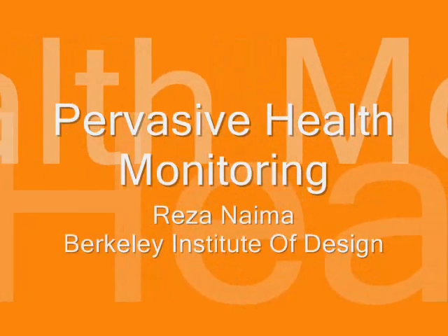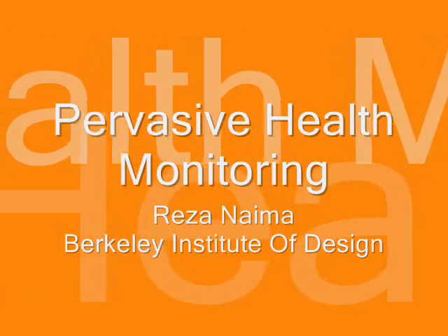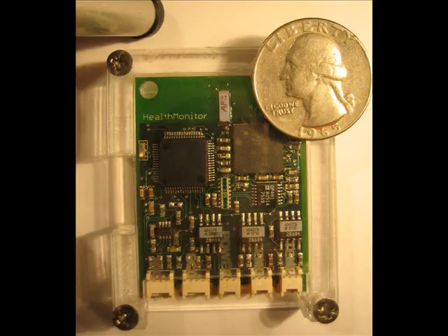This is a brief introduction to the pervasive health monitoring device developed at the Berkeley Institute of Design. The current version measures 1.4 inches by 1.8 inches and is designed to be ultra-low power consuming, small, yet support a robust set of features.